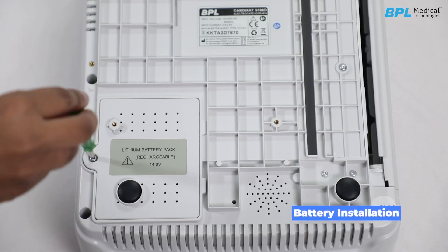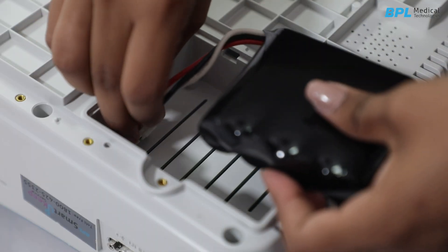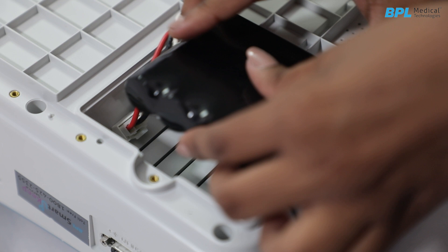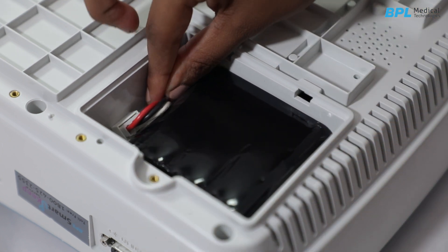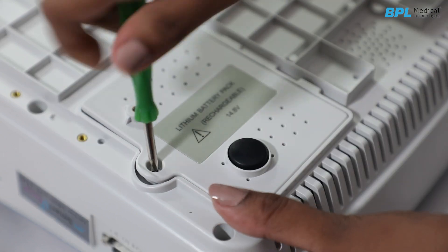To install the battery, take off the screw and lift the battery cover. Plug the polarized connector into the compartment and make sure it is locked in place. Arrange the battery cable so it does not get jammed. Put the battery cover back and tighten the screw.